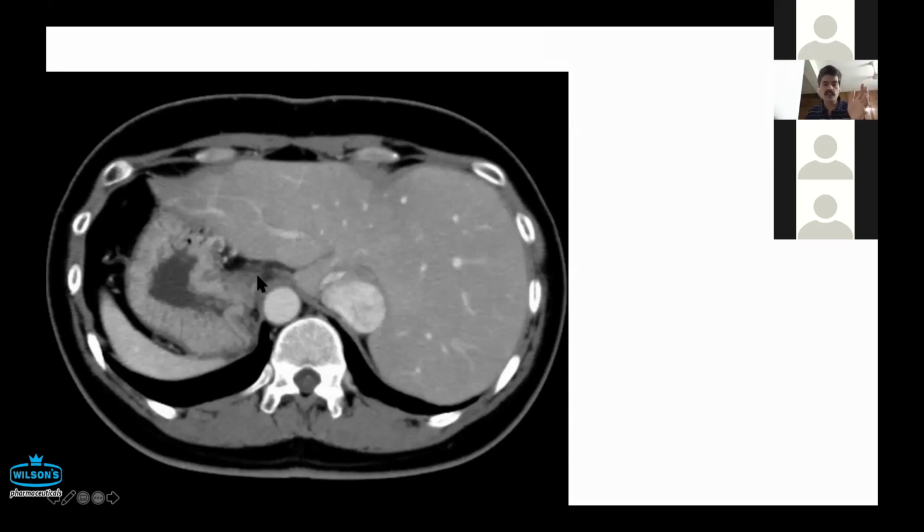So this is the stomach. My linear scope is here when I begin, and the probe points anteriorly. So when this probe is in my hand, the knobs are neutral. The probe is then pointing anteriorly, and what I see is the left lobe of the liver. Now this is the reverse orientation. I'm looking into the human body from above below.